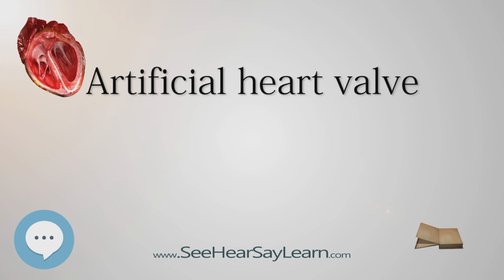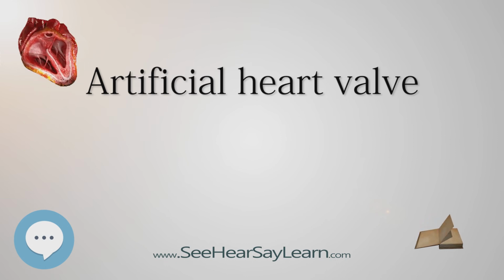Detachable and replaceable models of heart valve prostheses. Mechanical or biological, bioprostheses or tissue valves. The replaceable models of implantable heart valve prostheses are made by 2 or 3 mechanical components. The gear attachment mechanism usually uses the coil effect or the bayonet coupling system. The replaceable models of implantable heart valve prostheses are typically supplied with a sewing or suturing ring surrounding the valve body or stent that is to be sutured by the surgeon to the valvar rim.